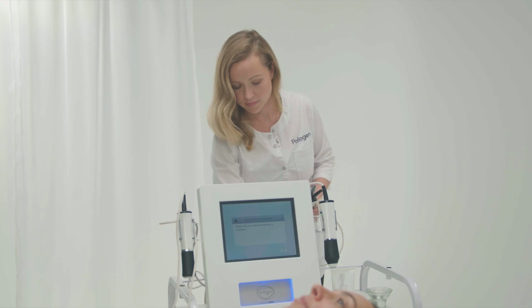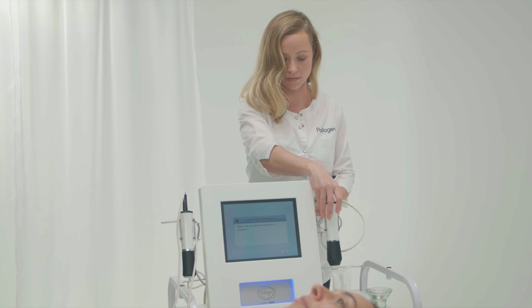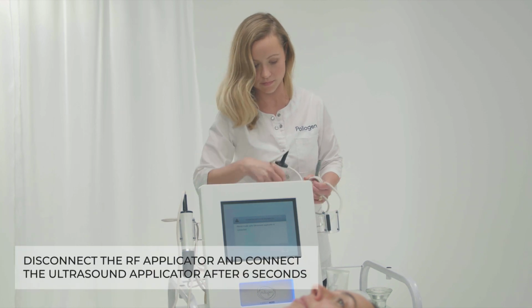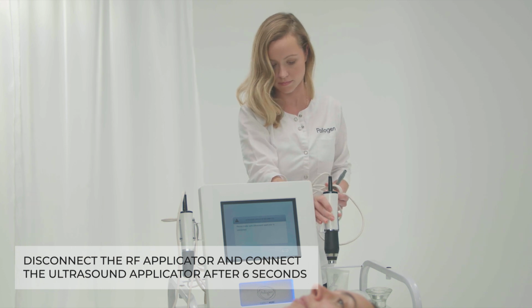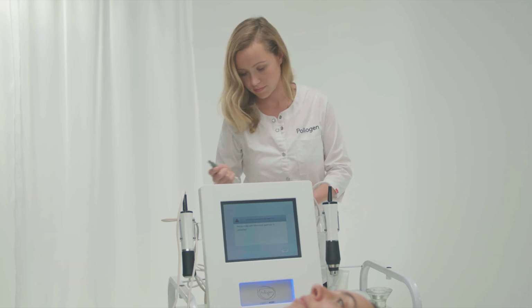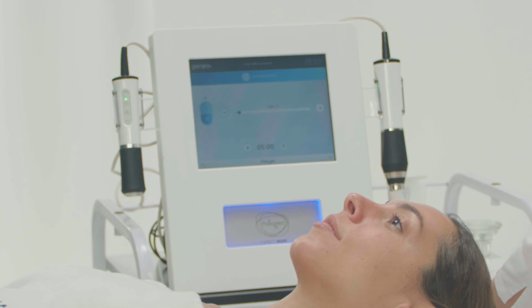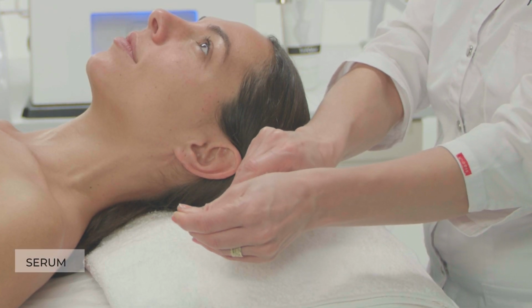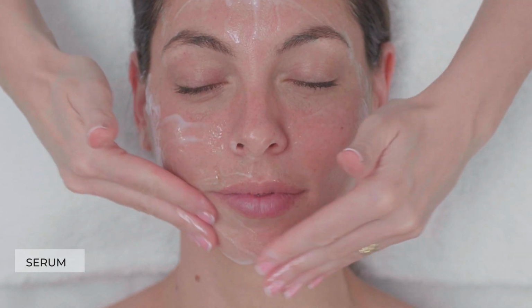The system will indicate you to connect the ultrasound applicator. Disconnect the RF applicator and connect the ultrasound applicator after 6 seconds. The platform will recognize the ultrasound applicator and you may proceed with the treatment protocol. Open a sachet of the serum from the kit and apply the serum on the treated area.